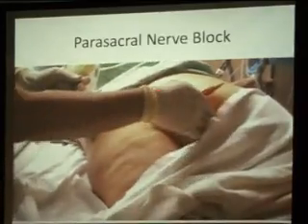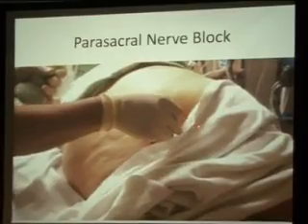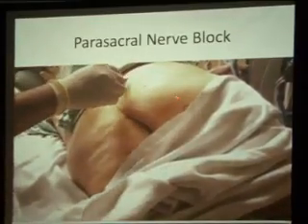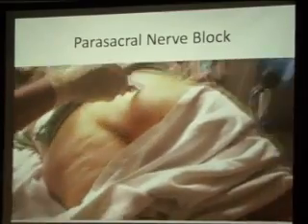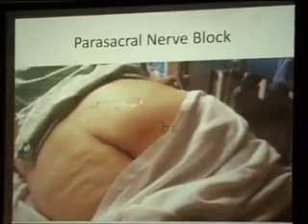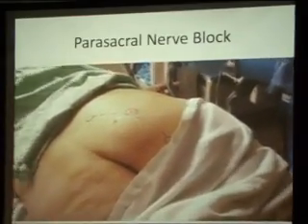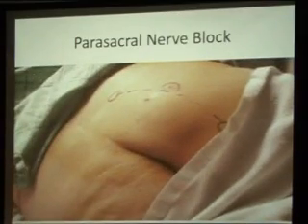That's the PSIS, and the ischial tuberosity, if you were to do a surface landmark based technique. If you were to draw a line connecting those 2 points, about 6 centimeters from the PSIS is where you would insert your needle if you were doing the landmark based technique. And we are pretty close to where we would have done it, it correlates pretty close to what we have done with our surface landmark.